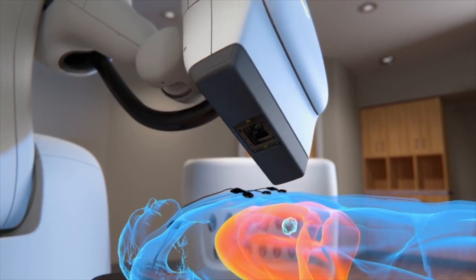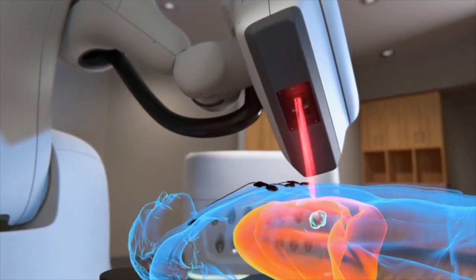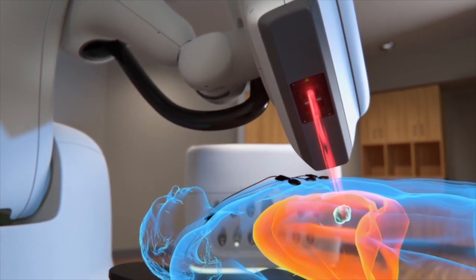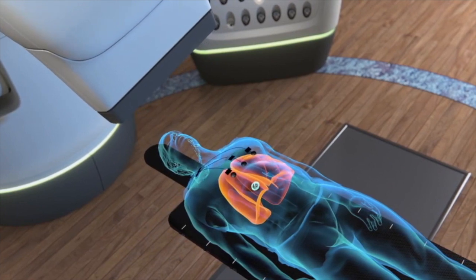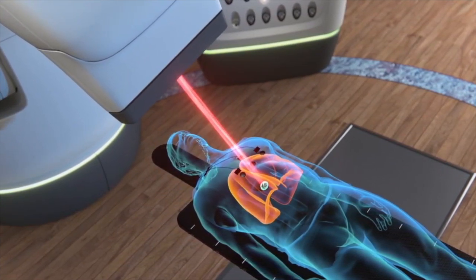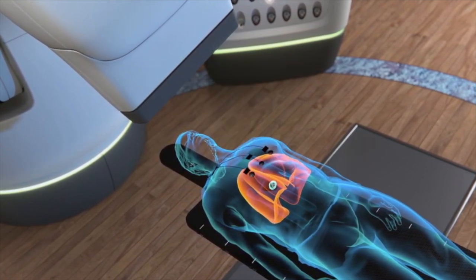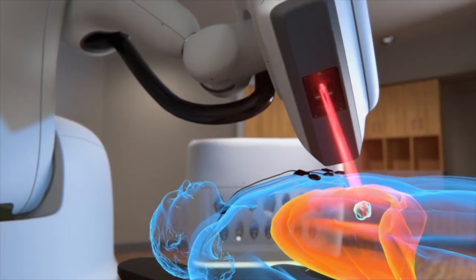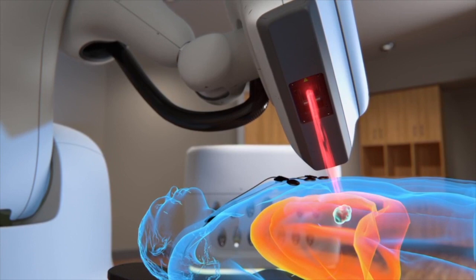The CyberKnife system architecture enables the delivery of treatment beams from hundreds of potential non-coplanar and non-isocentric angles around the patient. These beams are optimized during treatment planning with a powerful inverse planning algorithm to maximize dose coverage and spare organs at risk and normal tissues.